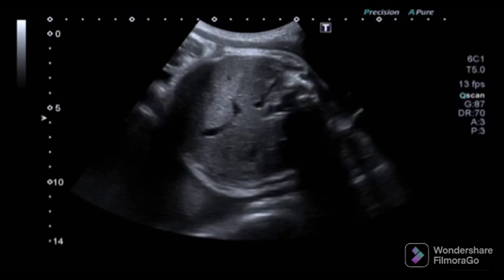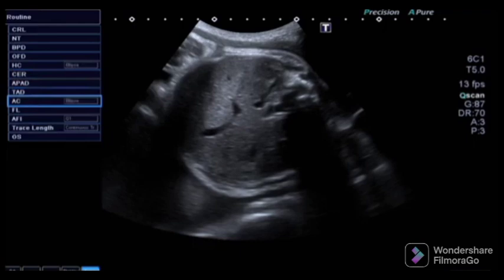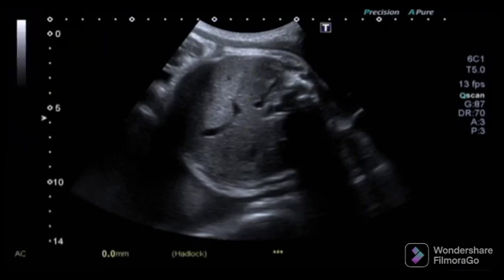There should be no kidneys or heart. The fetal spine is best positioned at the side. Place the calipers on the outer border of the abdominal skin.